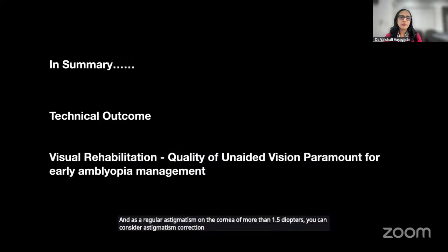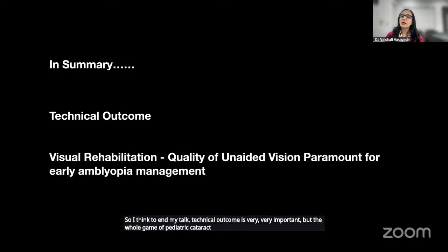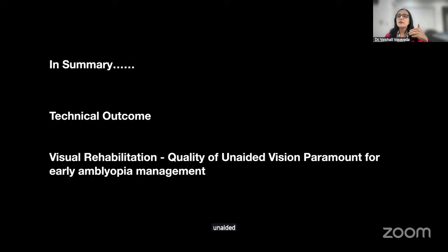And this is also what we published. So to end my talk, technical outcome is very, very important. But the whole game of pediatric cataract, if you don't match it up with your visual rehabilitation and particularly the quality of your unaided vision, then you lose half your battle. So thank you once again for the opportunity, and thank you for patient listening.